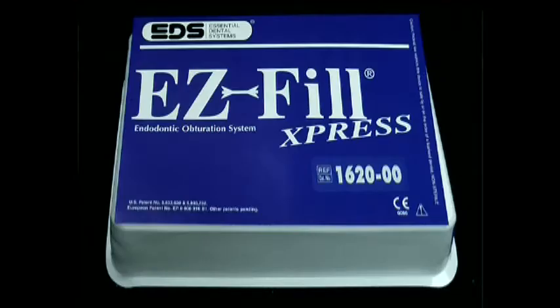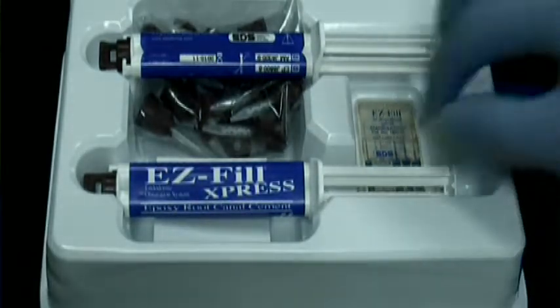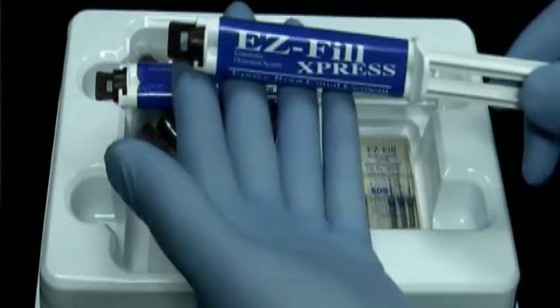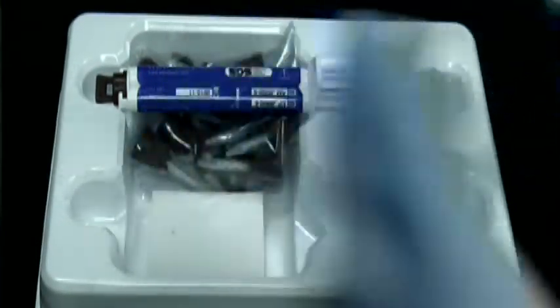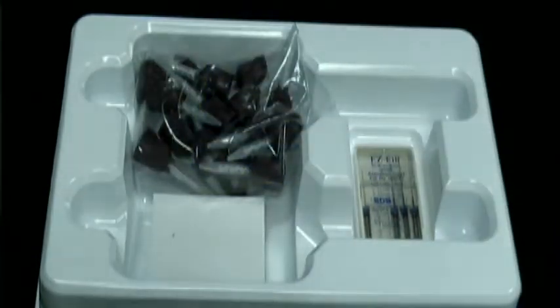I know that many of you have been using the EasyFill Obturation System, but it is now available in EasyFill Express. This is an auto-mix system. EasyFill Express comes with two complete syringes of the EasyFill material, AH-26 — the epoxy resin sealer — and a bag of the little mixing tips.